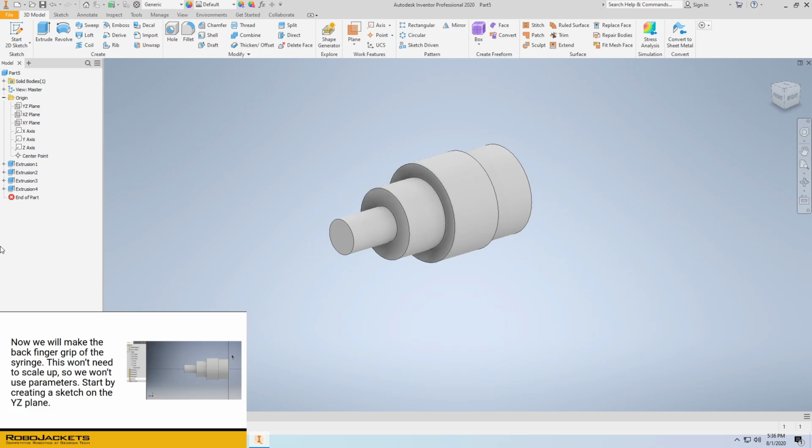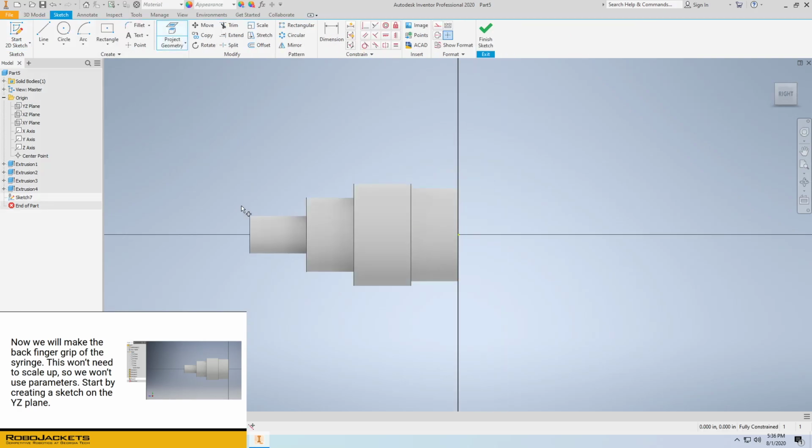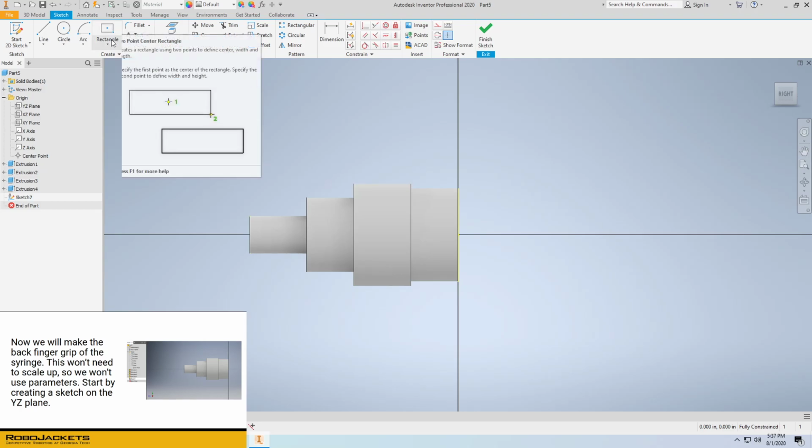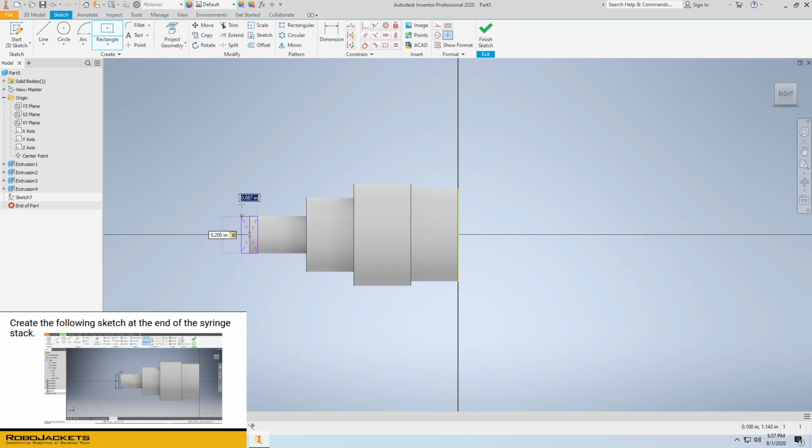Now we're going to add the back finger grip of the syringe. This won't need to scale up, so we won't use parameters. First, start a 2D sketch on the YZ plane, projecting the geometry for this line and this line. We will create a 2-point center rectangle, right? So choosing this one, centered at the very center of the left cylinder, with a height of 0.2 and a width of 0.05.